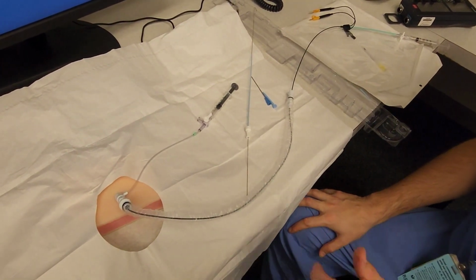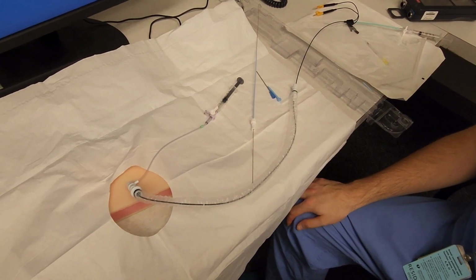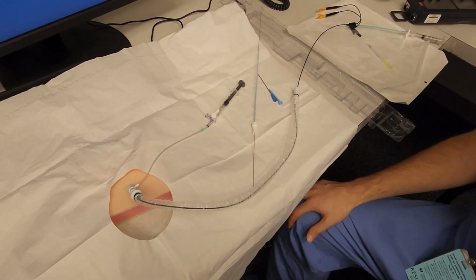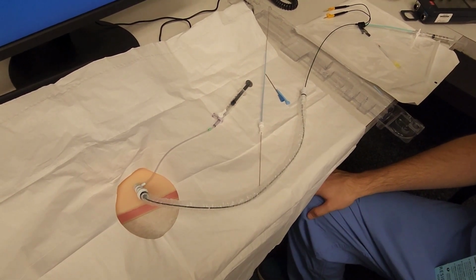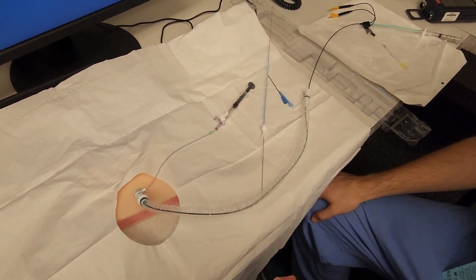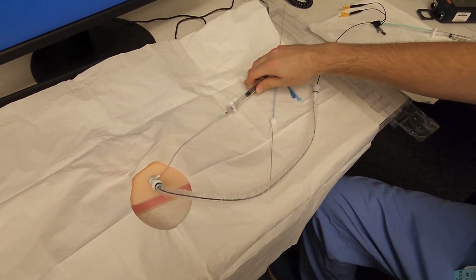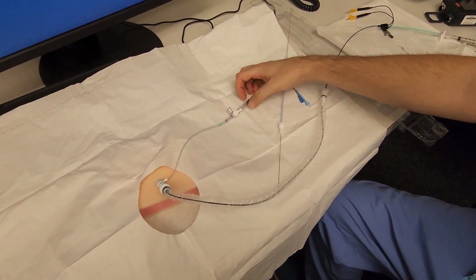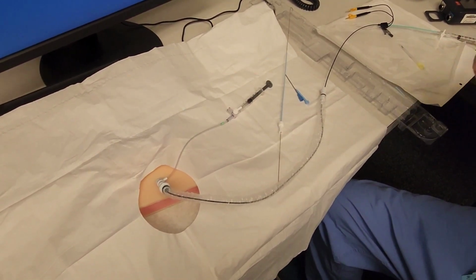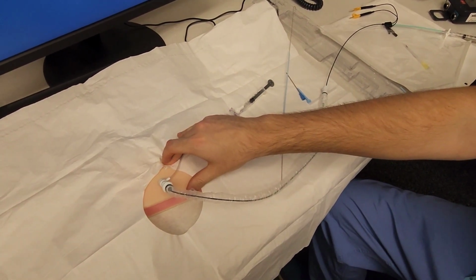If you overshoot and you're beyond like 40 centimeters and there's no capture, you may want to withdraw, but you can never withdraw with the balloon open, or you can shred the valve. So you need to deflate the balloon before withdrawing, and then you can attempt to reinsert again with the balloon up.